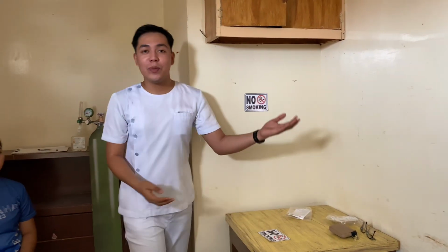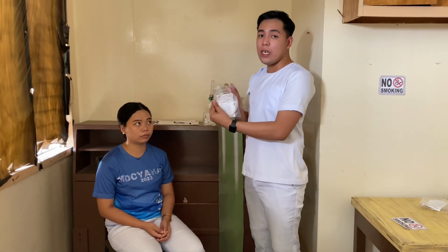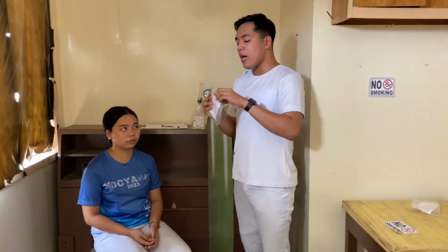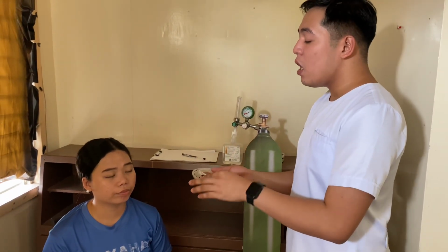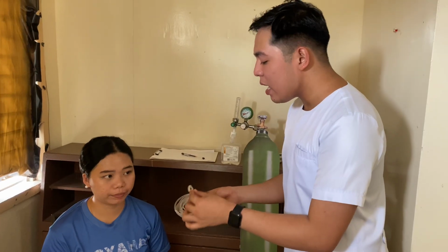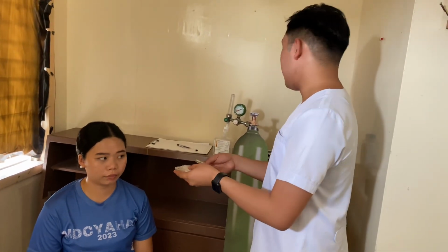Okay, after we put the no smoking sign, let's proceed to the next procedure in which we are going to show the nasal cannula to the patient and explain. As you can see here, I have the nasal cannula. So you open it and show it to the patient. Ma'am, this is the nasal cannula, which I will place in your nose, and it will deliver oxygen. The air comes out here, and I will place it in your nose later on.